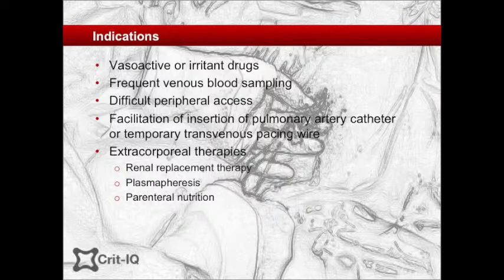Central venous access is also required for veno-venous or veno-arterial extracorporeal membrane oxygenation. However, this will not be further discussed in this module.